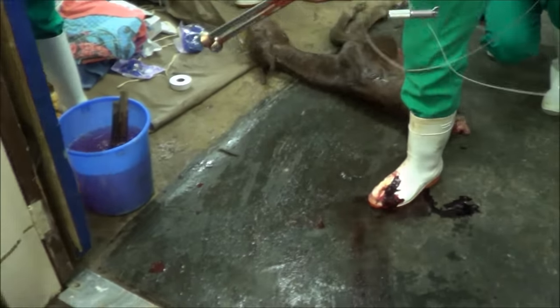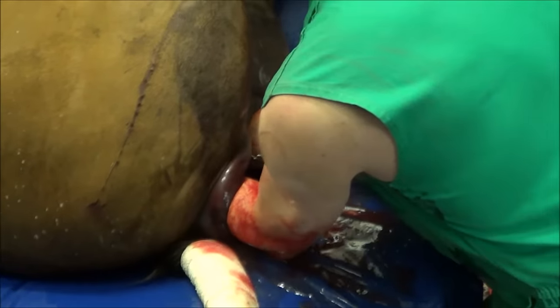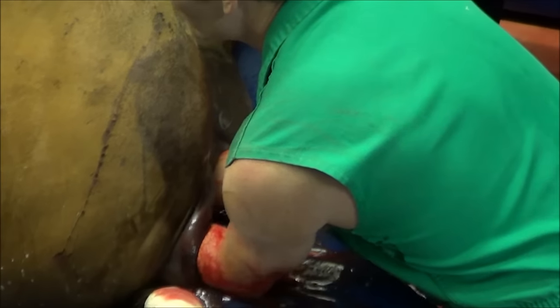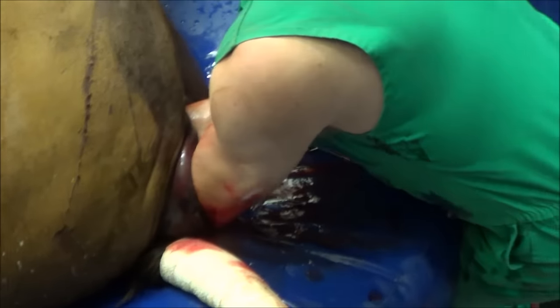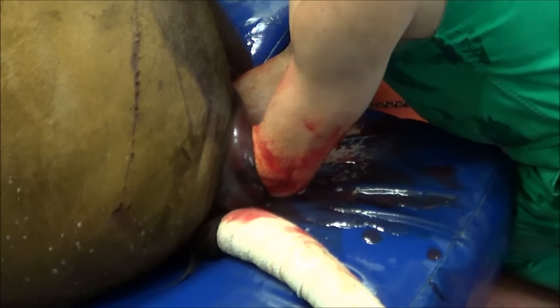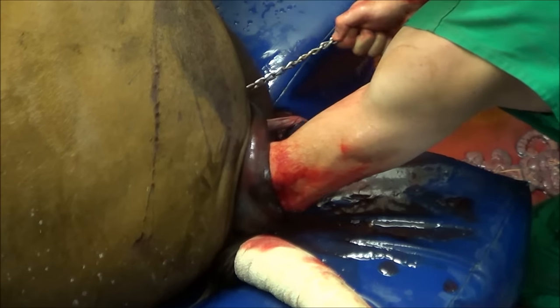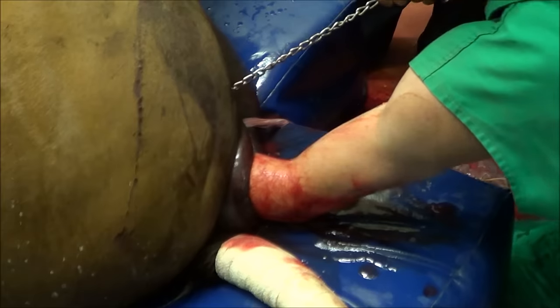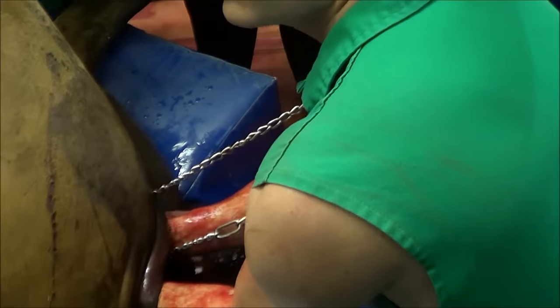Now obviously I need to remove the hindquarters of the foetus. So now you're holding the hind legs and you're going to push the rest of that while simultaneously pulling. Just try and turn it around.